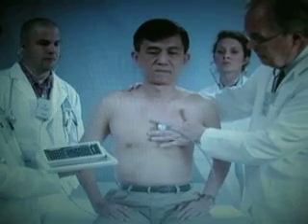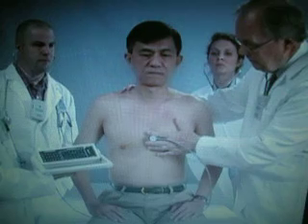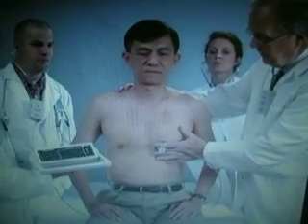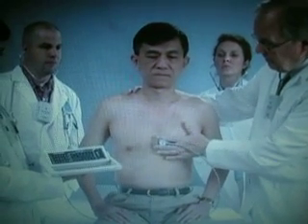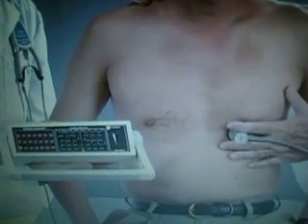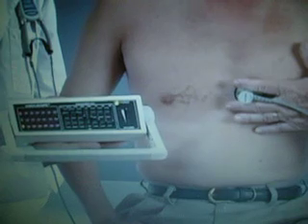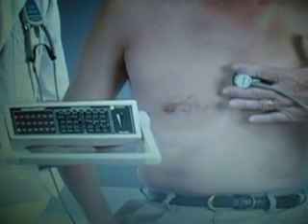Battery or line operated, the Simulscope may also be used for classroom teaching and also has been effective in telemedicine applications. Also, the patient's sounds from the Simulscope and ECG can be stored and displayed on a laptop computer screen using the StethView digital recording system software. This software will display the sounds as they are being recorded to provide a library of sounds that can be played back later for studying and teaching.